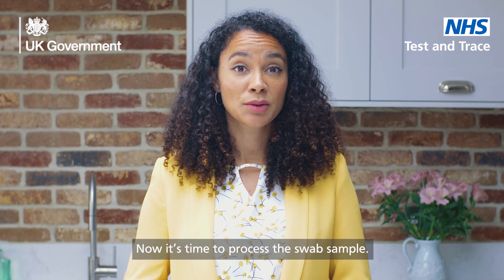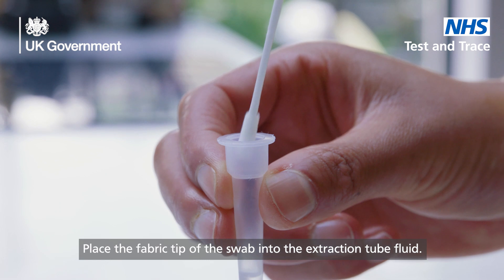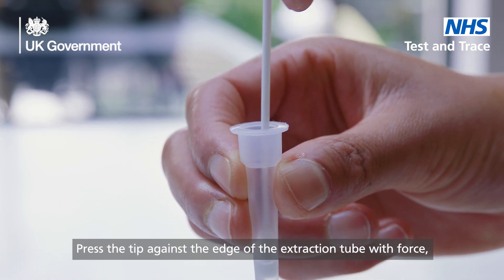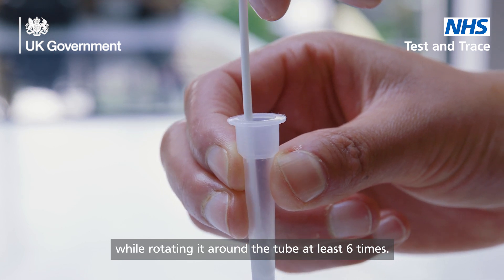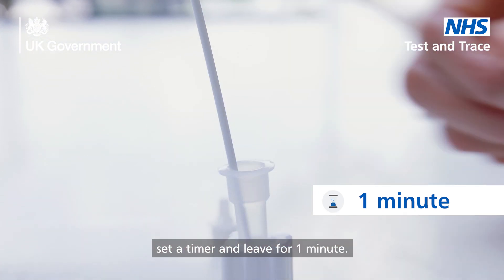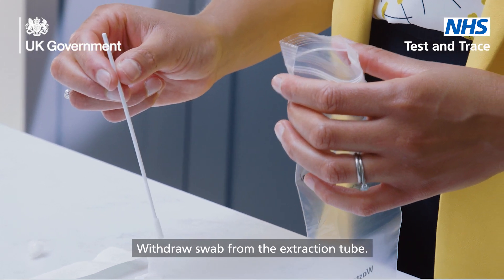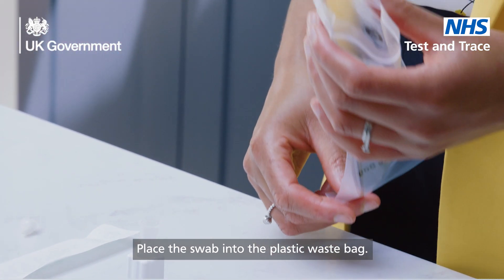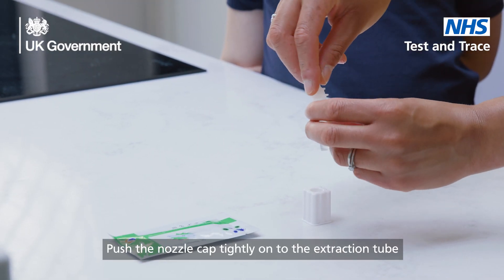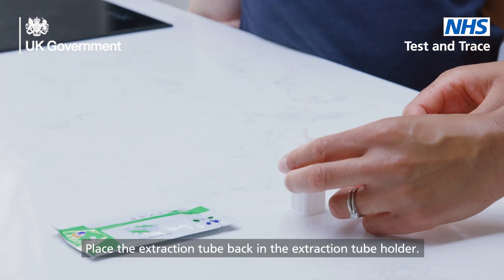Now it's time to process the swab sample. Place the fabric tip of the swab into the extraction tube fluid. Press the tip against the edge of the extraction tube with force while rotating it around the tube at least six times. Leave the swab in the extraction tube, set a timer and leave for one minute. Withdraw the swab from the extraction tube and place it into the plastic waste bag. Push the nozzle cap tightly onto the extraction tube to avoid any leaks. Place the extraction tube back in the extraction tube holder.